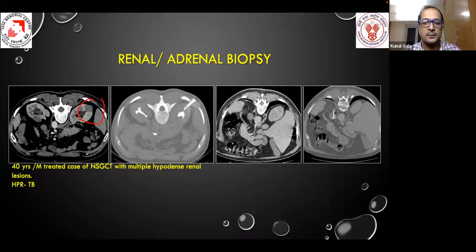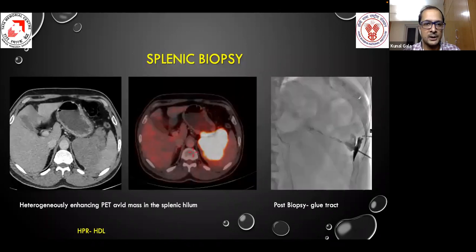So this is another patient where an adrenal biopsy can also be performed. For adrenal biopsy, if the lesion is seen on ultrasound, we can do an ultrasound guided biopsy. But if it is located much deeper, and if it is a bulky, fatty patient, one can do a biopsy by going through the caudal aspect, then tilting the needle cranially and entering the adrenal, and then do the biopsy.